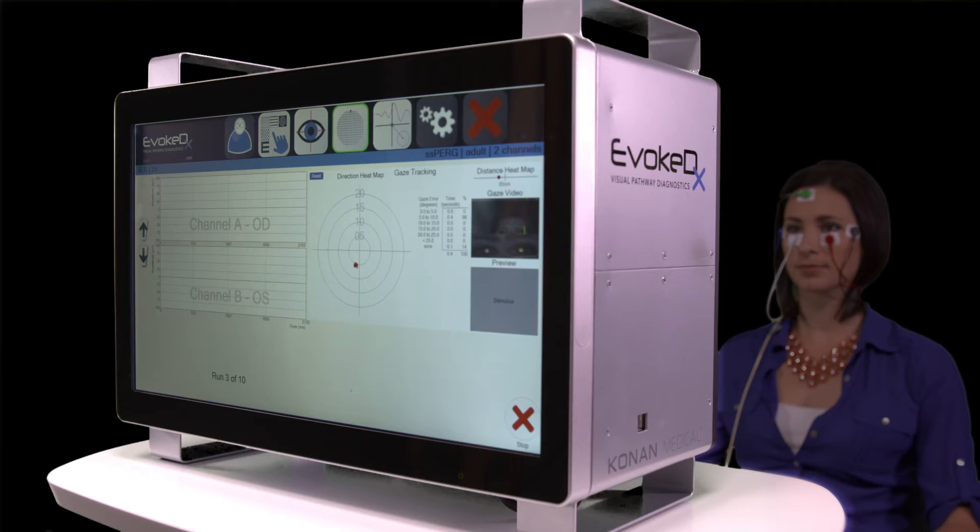Infrared gaze tracking allows the technician to easily monitor patient attention and fixation, and the dual channel amplifier enables simultaneous recording of bilateral ERGs.